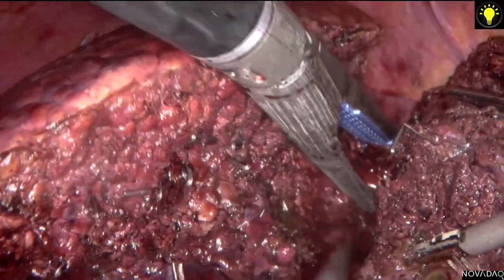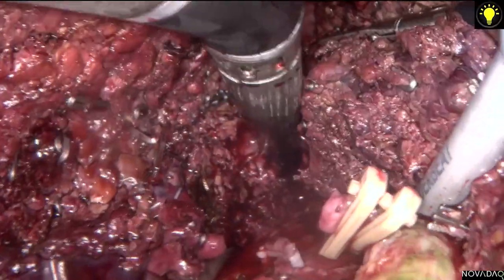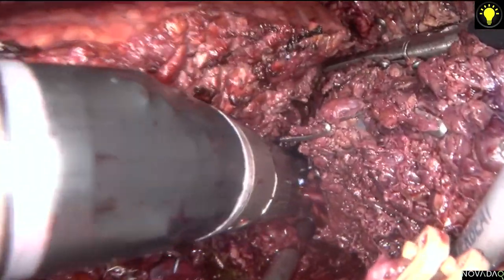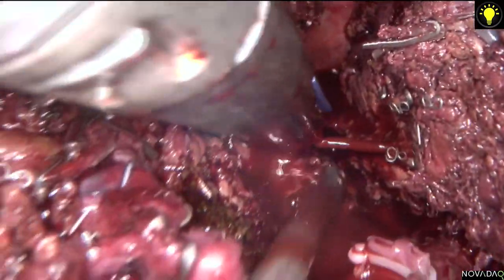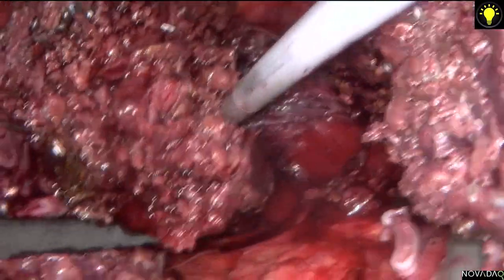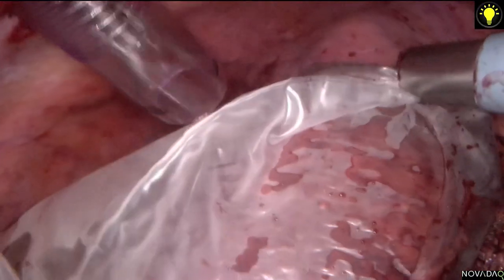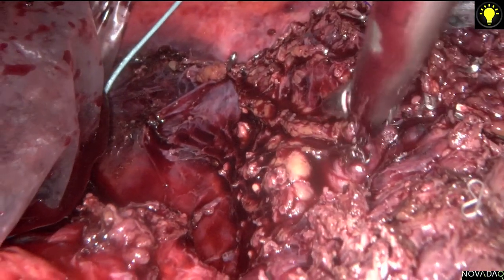In this case, we can see the right hepatic vein was fully exposed. A vascular stapler is applied to the right hepatic vein, and the right hepatic vein was divided. Small oozing was noted at the edge of the transection site. It was temporarily controlled by compression, and the specimen was put into an endo bag. After compression, there is shrinkage of the leakage site, which can be controlled by intracorporeal suturing.